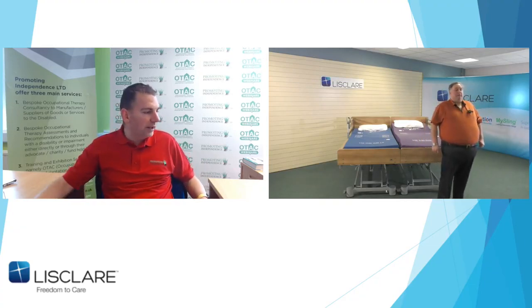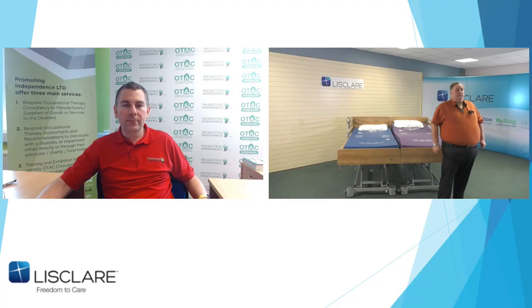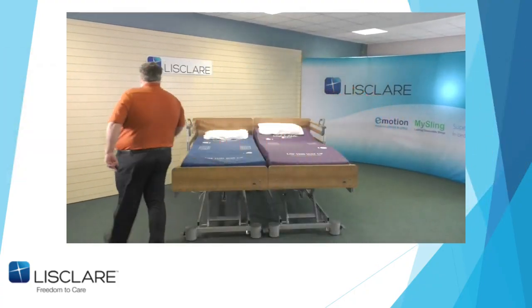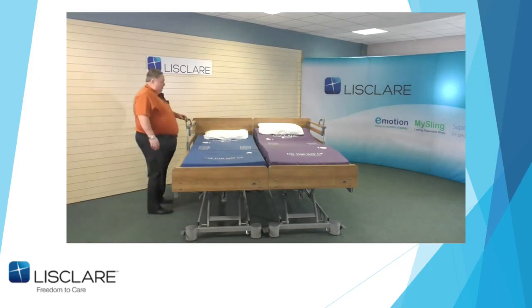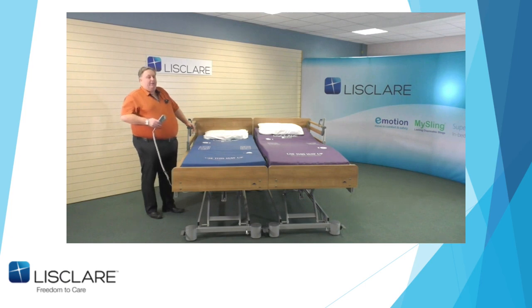Brilliant. We've got a question. Can you just run through each of the components? So, for example, the back rests, the leg rests, which bits do raise independently and which bits don't? Right, good question, Stuart. Didn't expect that one. When you're profiling a bed, a carer should always lift the leg rest first, okay? So you'll see me lifting this leg rest up ever so slightly, and then lift the backrest.